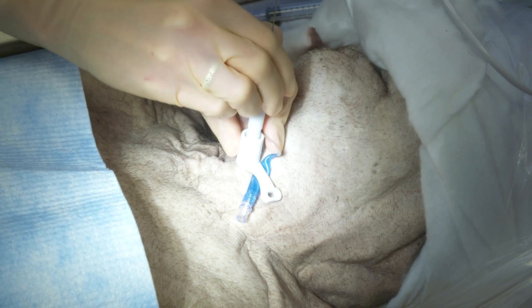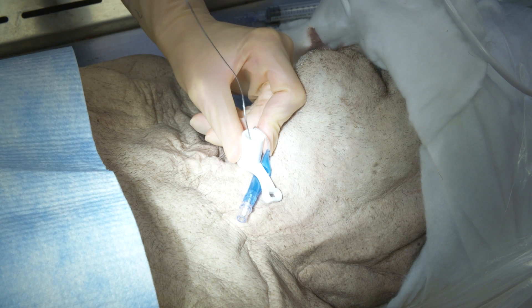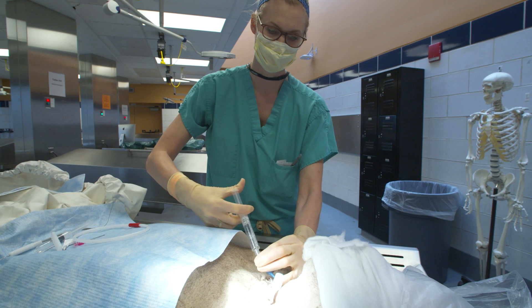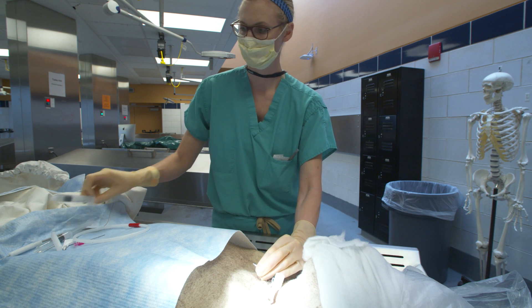After advancing the tube to its hub, remove the dilator and secure the tube with your fingers. Inflate the cricothyroidotomy tube cuff, ventilate the patient, and check for proper location by CO2 detection methods, lung auscultation, or bronchoscopy. Secure the tube using the attached ties and be sure the patient is sedated, has pain relief, and is restrained, thus unable to self-extubate. Consult your surgeon as a more secure and revised airway may be best.